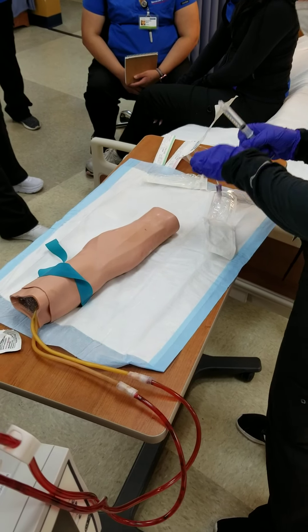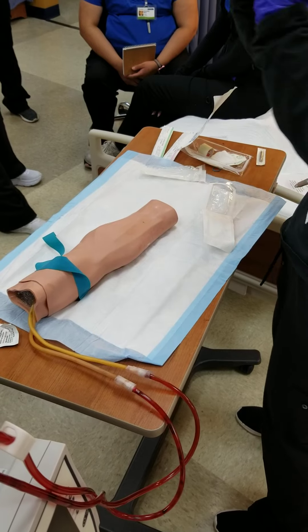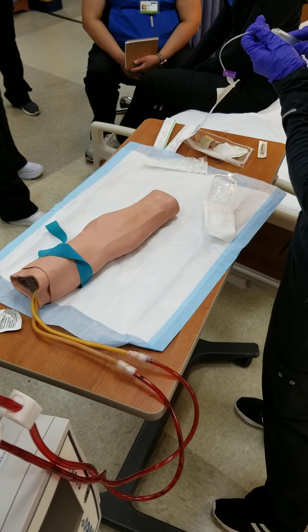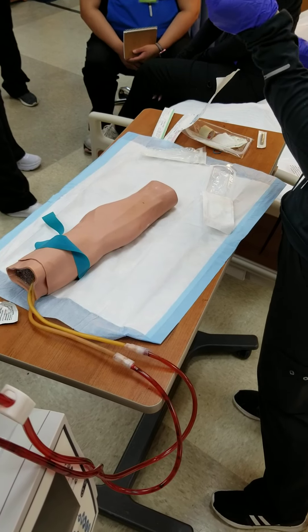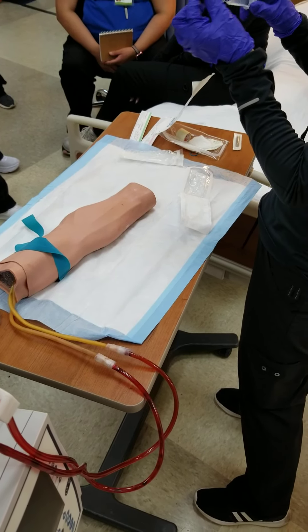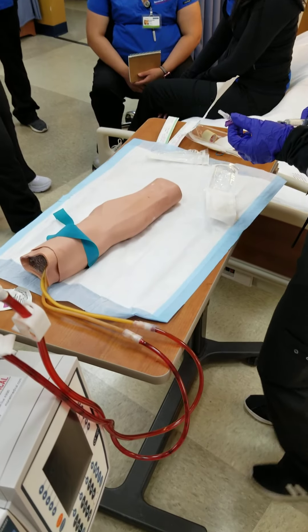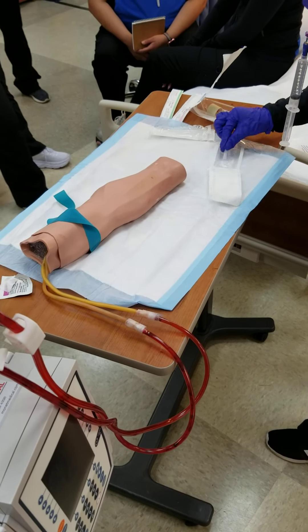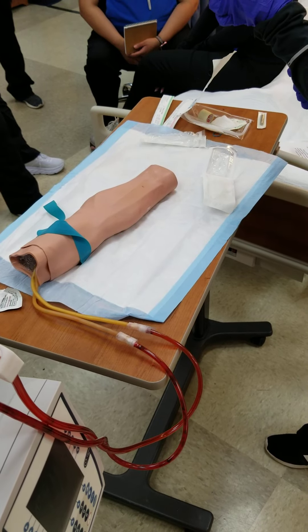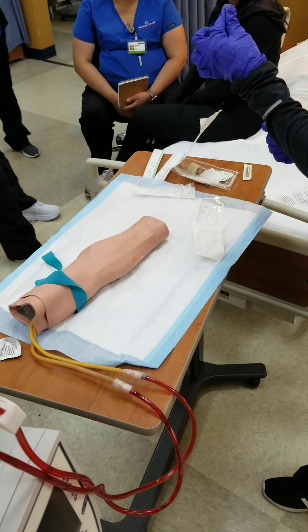What is in this tube right now? Nothing. So we can't just hook it up and be done with it — we need to prime it. Because if we insert this air into our patient, what could happen? Kill them? Yeah, let's not kill anybody. So we just squirt the fluid through until you see it come out of the tube.